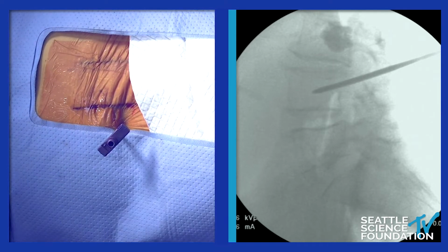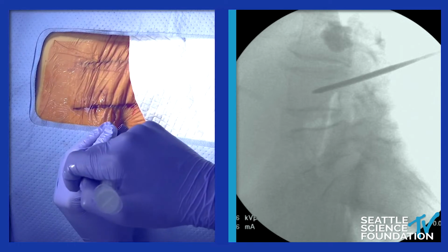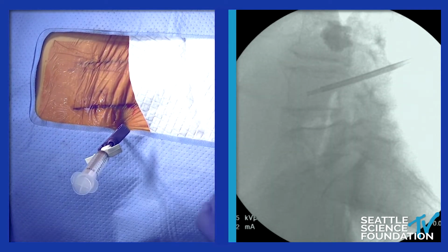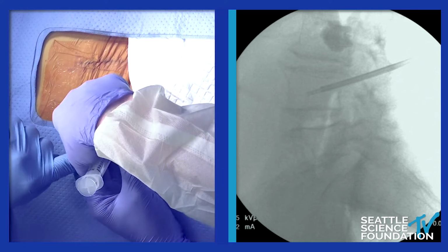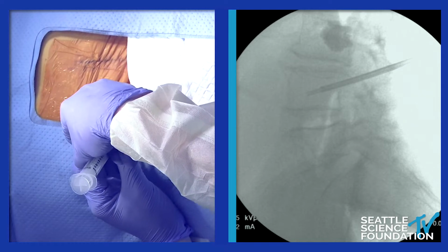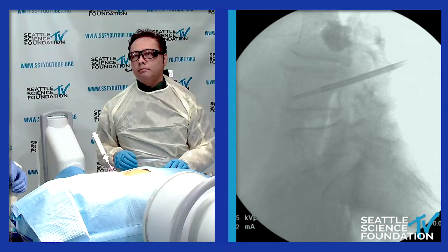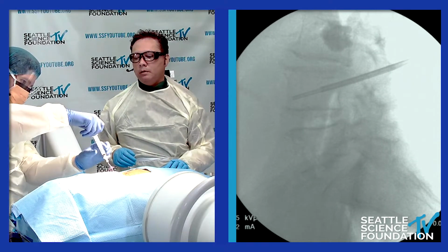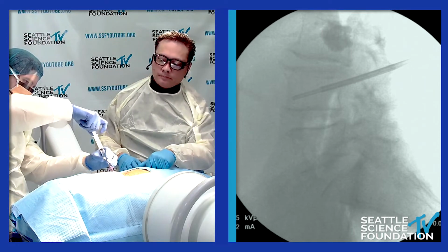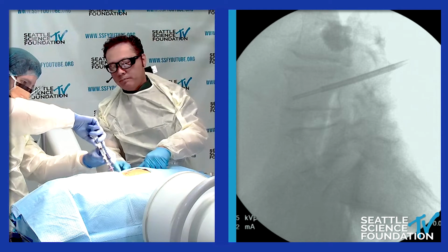Should we let Yev redeem himself? See how the depth of it. There you go. There's a little marker there showing how deep we should go. Take it back a little. Great. And aspirate. Oh, there he is. And pull back. Yev is back. All right, go ahead and pull the sample straight out.